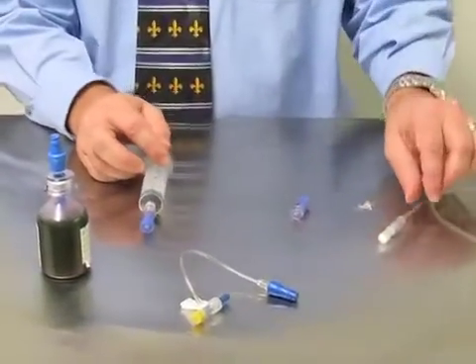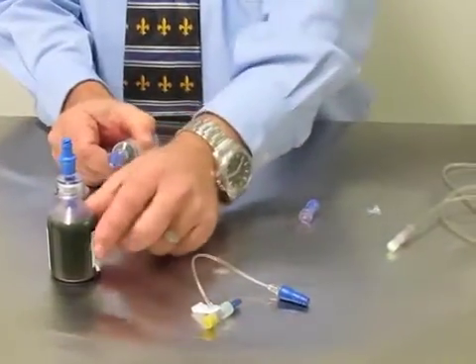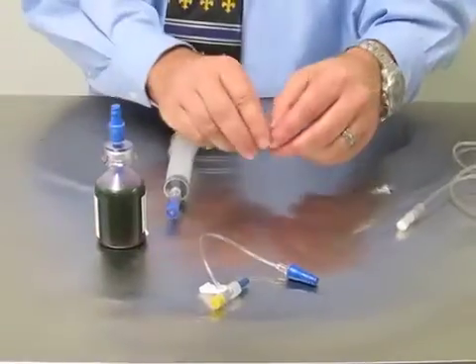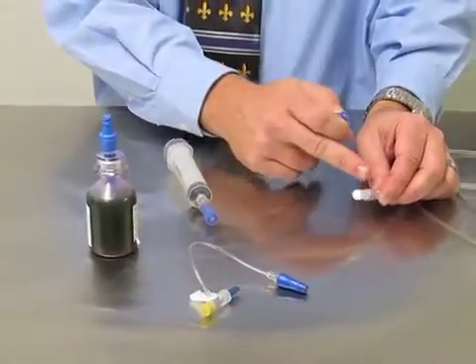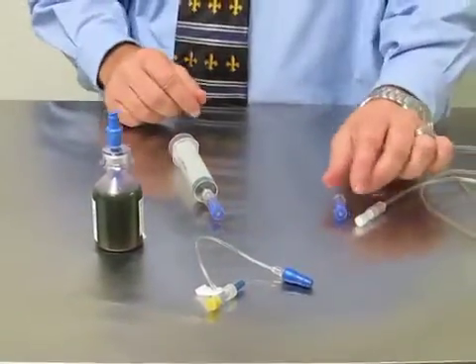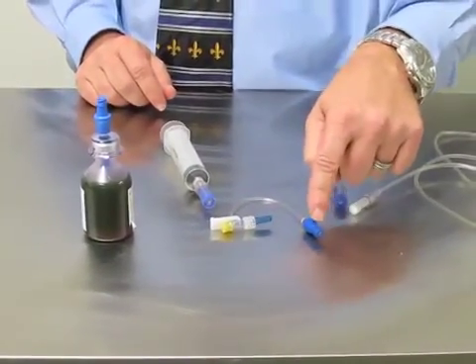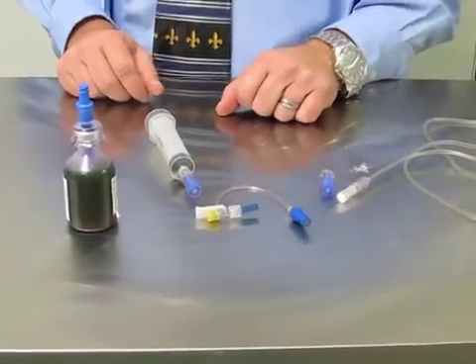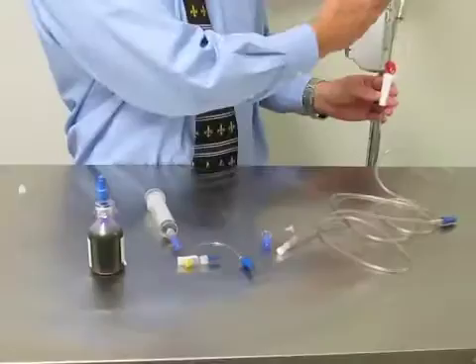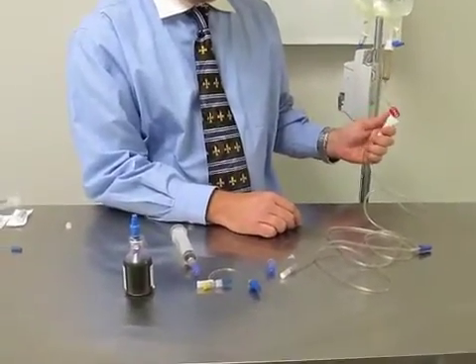For constant rate infusion administration, I'm going to need a syringe with a Spiros, my drug with a vial adapter, an extra Spiros to add to the end of my IV line after it has been primed and before I put my drug in, and on the patient's side a T-port with a microclave or just a microclave on the IV catheter. To start, I'm going to prime my IV set — I've spiked the bag and I'm just going to open the line and let it prime with saline.